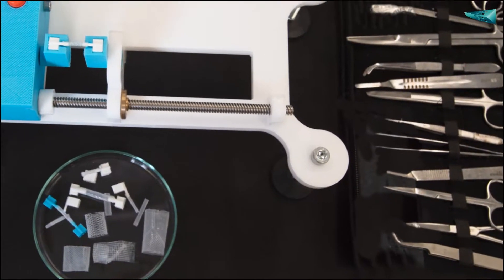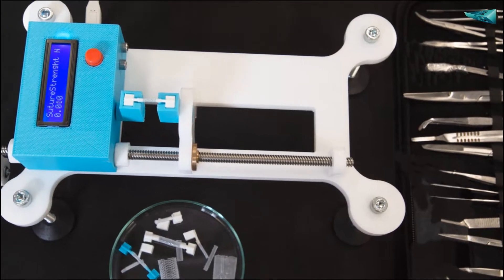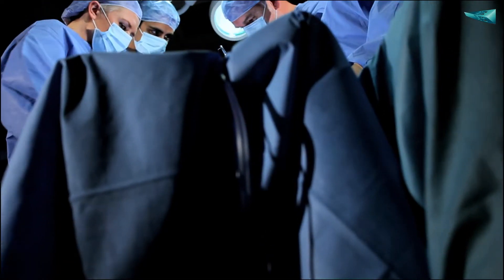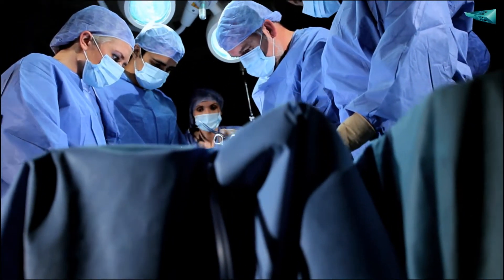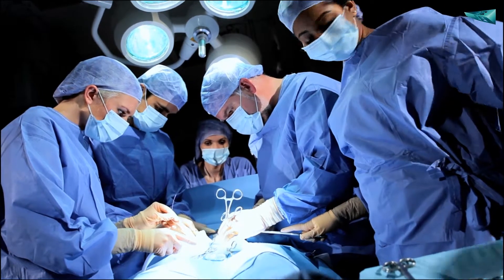This is Easy Surgery, the first affordable, intuitive, and accessible microsurgical training device for doctors of all levels. Suturing is one of the most essential skills that students and junior doctors have to master in order to advance in their profession.